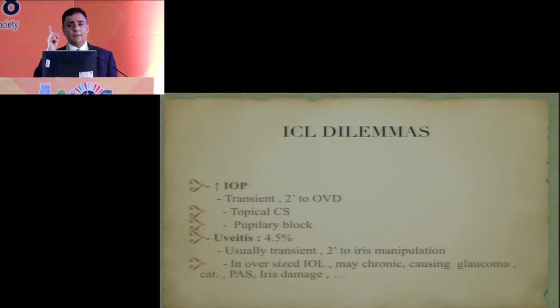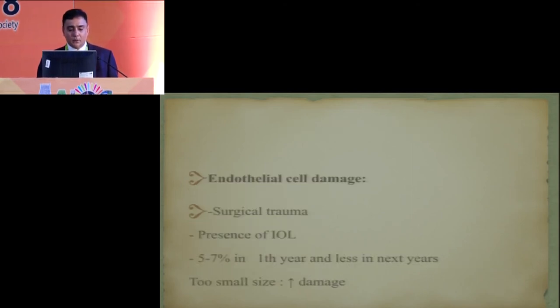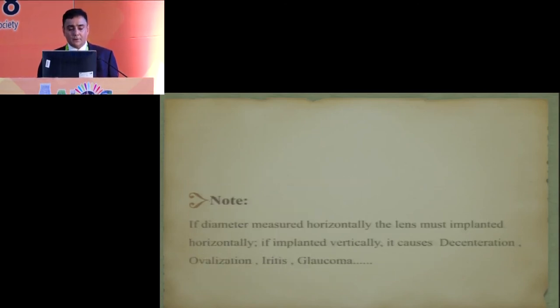The new ICLs have a central hole, so you really don't need to do an iridectomy, which was necessary in the past. That is not really necessary. Some of them do develop uveitis and endothelial damage, surgical trauma. All this is routine, what can happen because of surgical problems.